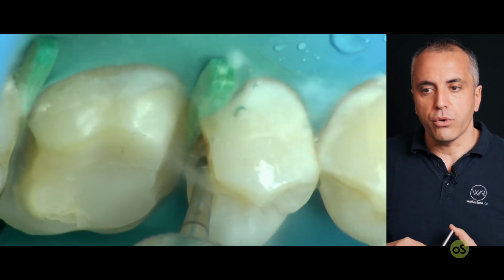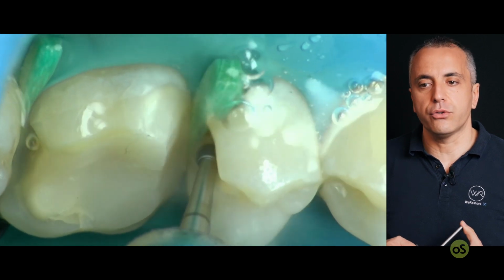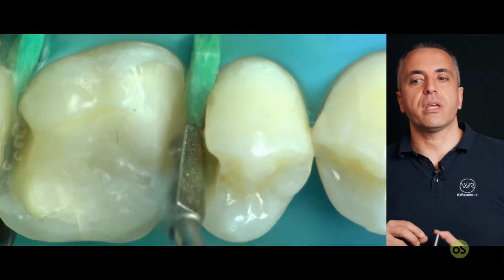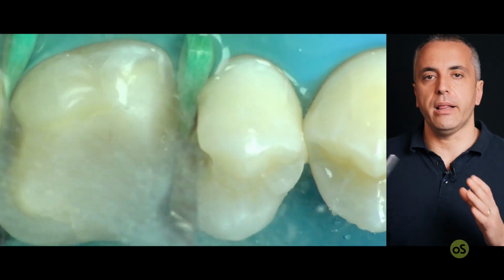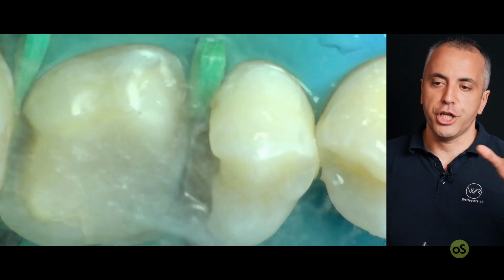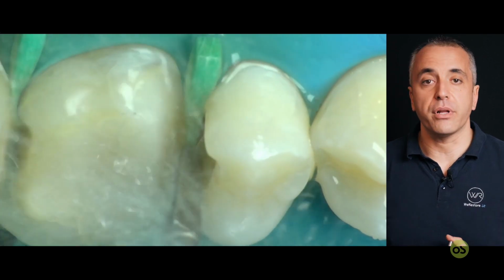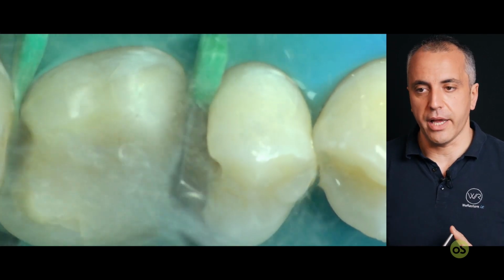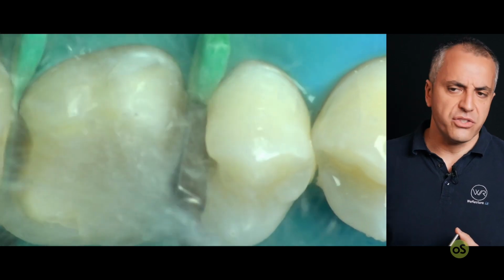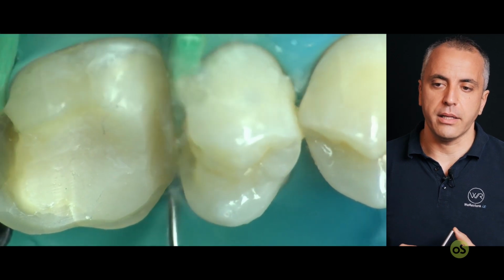So I moved to a low-speed carbide burr to remove infected dentin, and then moved back to the sonic instrument to define well the cervical margin and the axial wall. I repeat, this can be substituted by a flame and the burr that cuts only on the head. Look once again at the burr that is destroyed, ruined by the instruments. We don't really care. It's very useful.